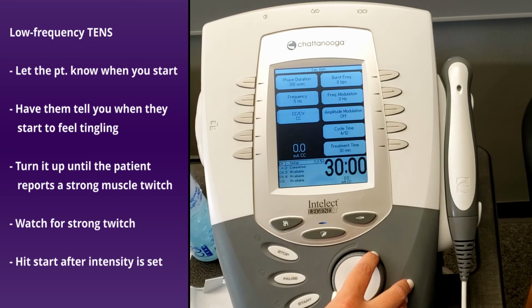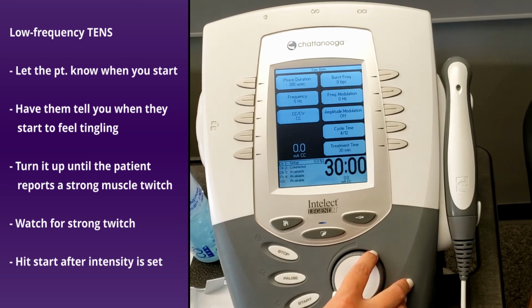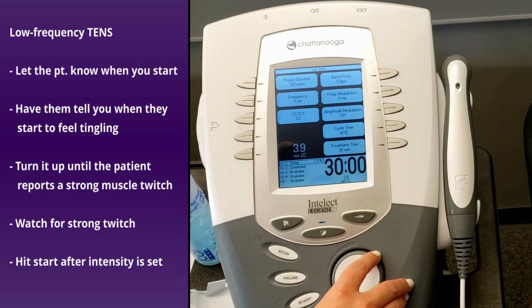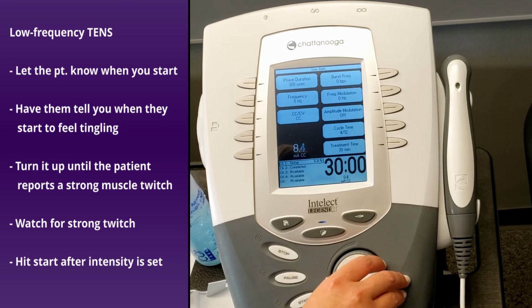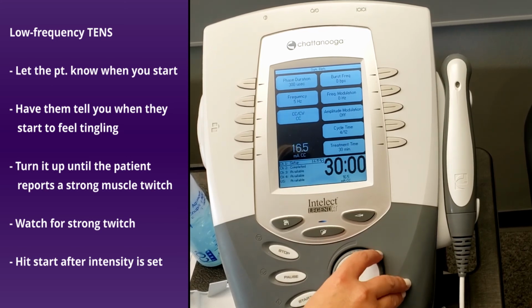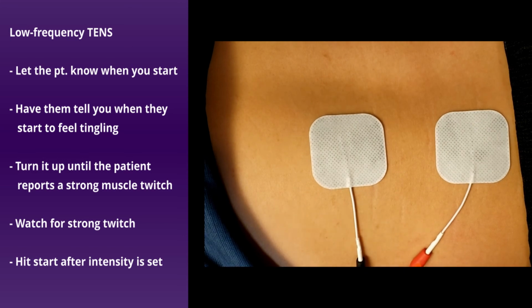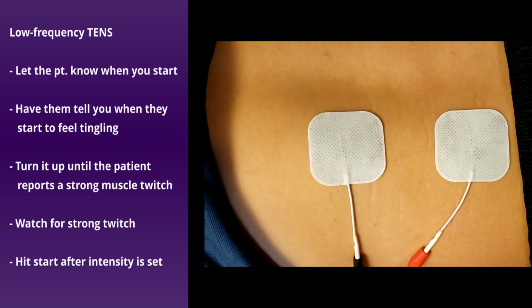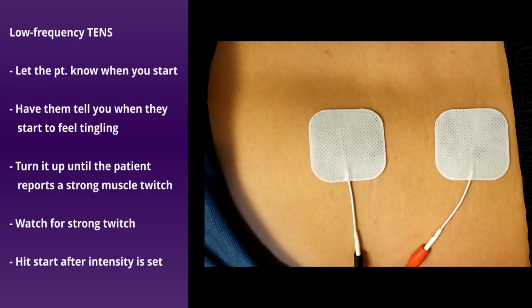I'm going to start turning up the intensity. What you should feel is a strong but tolerable muscle twitch. Let me know when you start to feel it. I'm starting to feel it. Does it feel like a muscle twitching? Not yet. Any twitching? Now I feel it. That's strong. Is it tolerable? Yes.